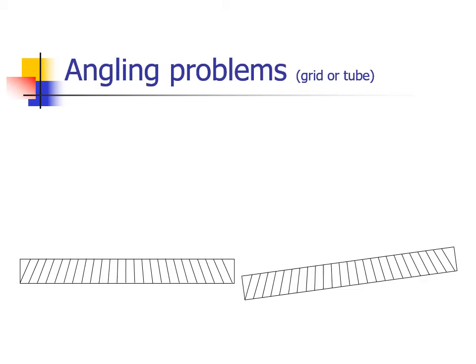Angling across the width of all types of grids will cause cutoff error. This explains why positions that require the use of a grid and an angle across the table do not exist. It also explains why one must be careful when using a grid for portable or bucky work.